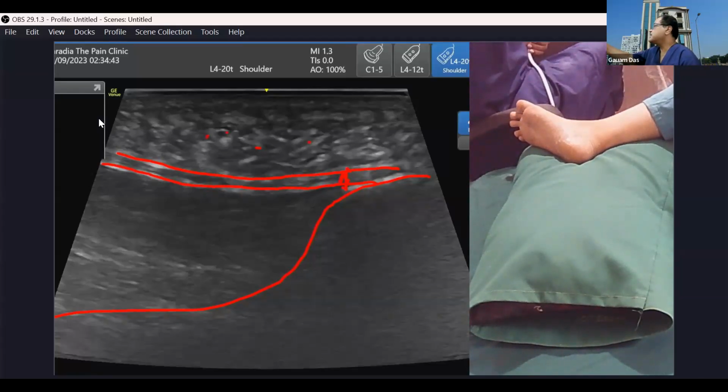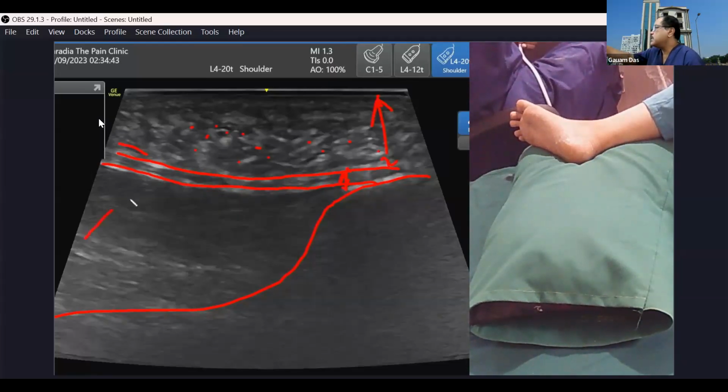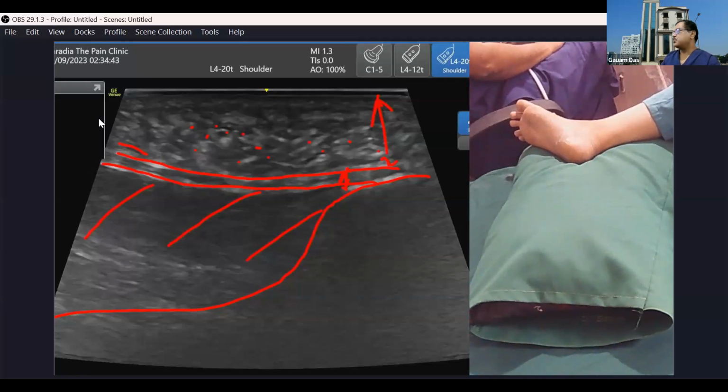So this is your fat pad. This fat pad is most thick towards the heel, and it will gradually become thinner when you go more distally towards your metatarsal area. Then you can see the two muscles there. If you can remember, what are the two muscles there? The topmost layer, the first layer muscle in the middle, what was the name of that?